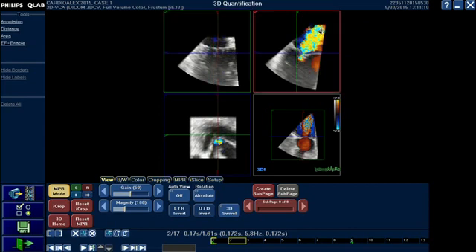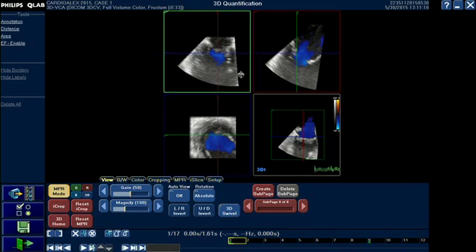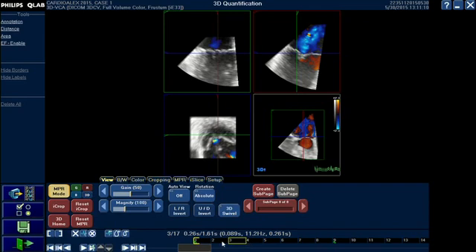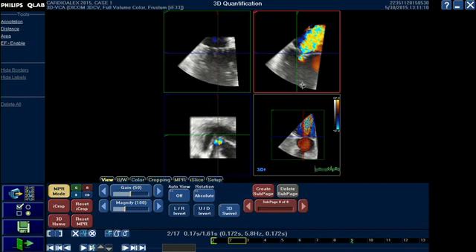Here I can see the mitral regurgitation jet. Starting from frame one, since this is an ECG-gated acquisition, the first frame is usually end-diastolic. I have to move frame by frame to see what's happening. Now I can see a regurgitation jet. In frame three the regurgitation becomes less. So I will choose the frame showing the maximum regurgitation jet. This is where variability can come in — one colleague may measure a different frame than another, and this variability is the same as with 2D vena contracta measurements.